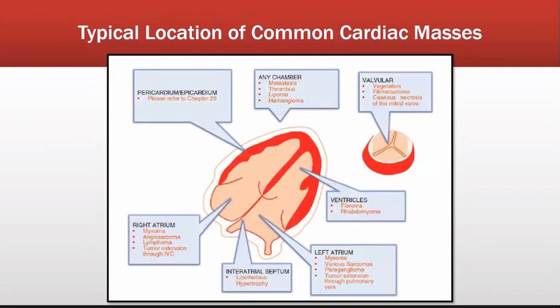It is important to know the typical location of the cardiac masses. As Dr. Anil Ahuja is always saying during his talks, location, location, location. You can narrow down your differentials based on the location of the tumor. So please remember this slide.